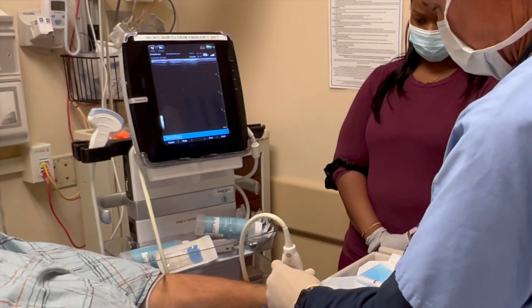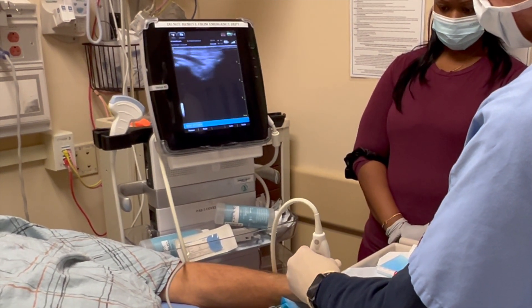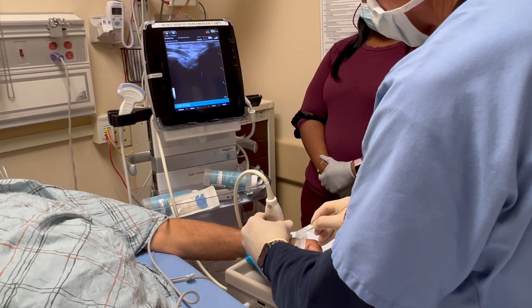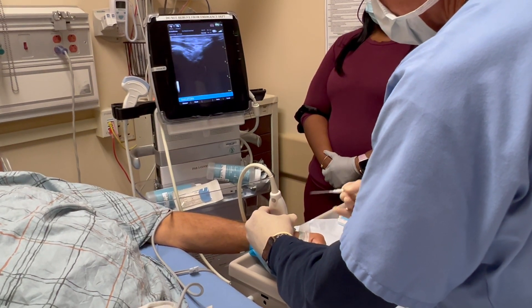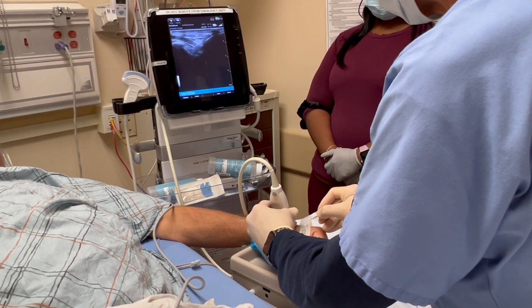Here you can see a video of the A-line actually being placed. If you look carefully, you can see the artery at the top of the ultrasound screen there. It's in the longitudinal direction — there's the artery there. And if you look real carefully, you'll see the needle go into the artery.